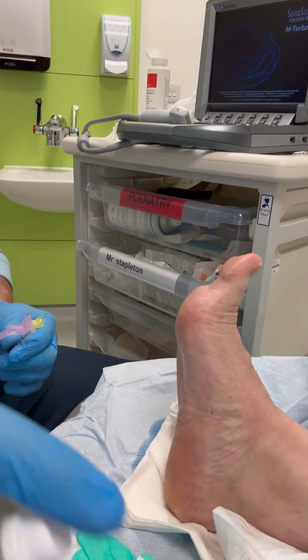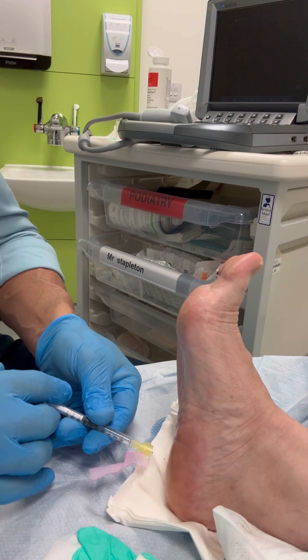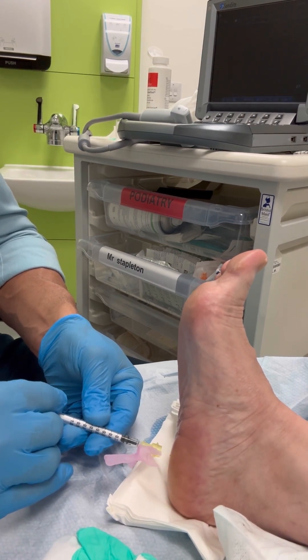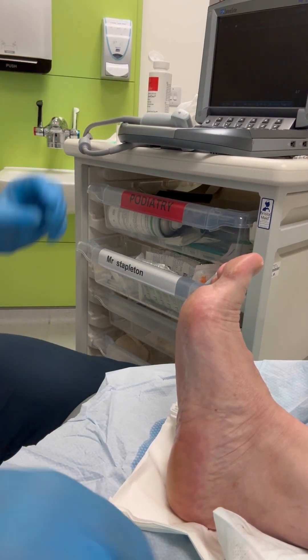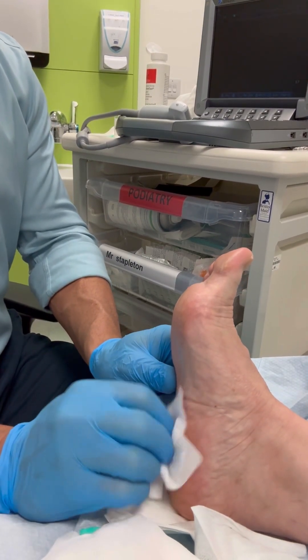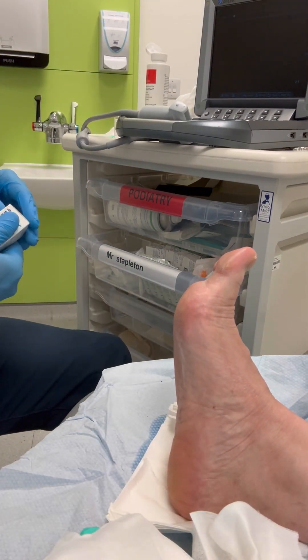Welcome back, I'm Liam Stapleton, consultant podiatrist and specialist in podiatric sports medicine, and we're going to take a look through another treatment video. Today's demonstration is of a plantar fascia injection of corticosteroids. I have a slightly unique technique when performing this injection — there are several techniques that can be used, and this is my favourite as it seems to be the most comfortable for most patients and gives me accurate injection with good results.